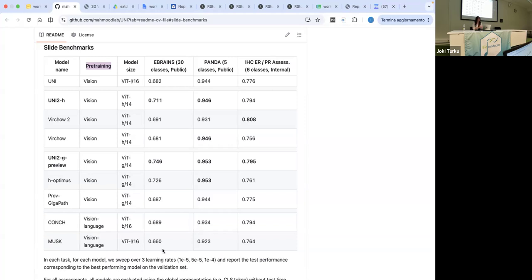The foundation models are pre-trained on a lot of different images, but sometimes maybe there are too many. I don't know. There is a limit of images to pre-train on, because at some point the information can be redundant, or there can also be biases, because as you saw from the number before, if you train on the wrong data, it will not predict so well, like the 4.